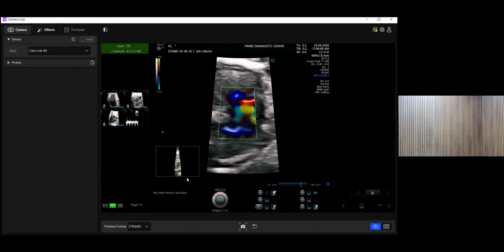Adult echo is like a 64 slice CT and fetal echo is like a 4 slice CT. So that thickness issue is a big problem when the heart is small, and then a lot of things evolve. Missing a small lesion is a problem. Adult echo, they would recommend in case the patient has some symptoms or ECG abnormality.